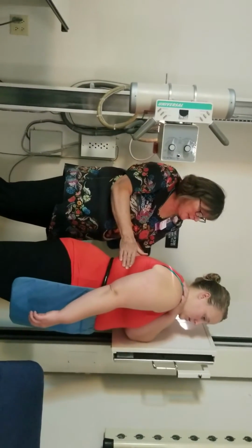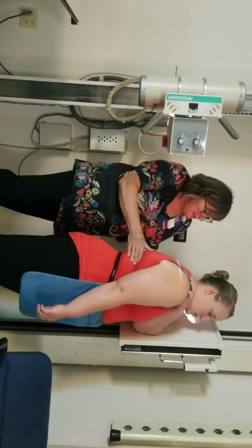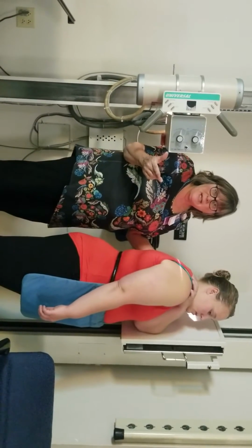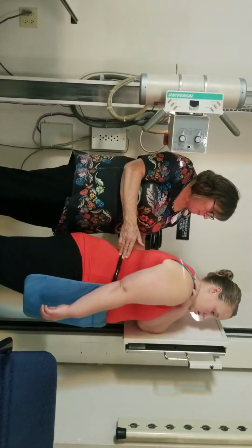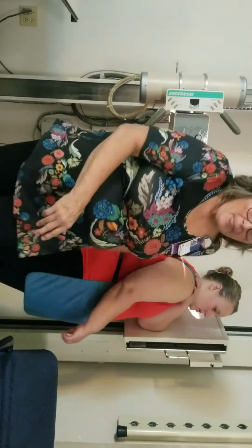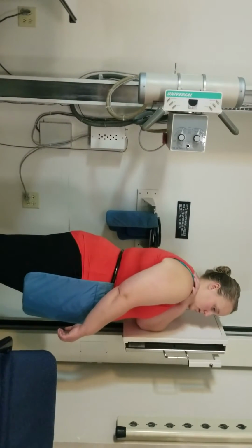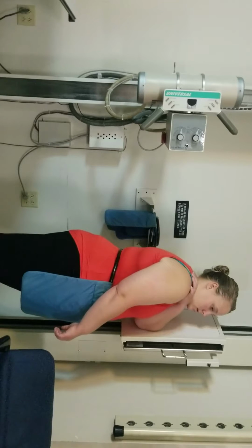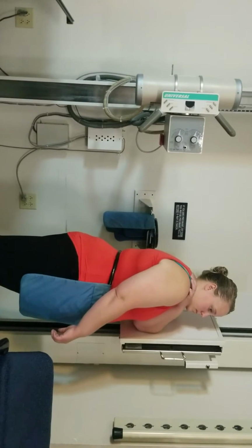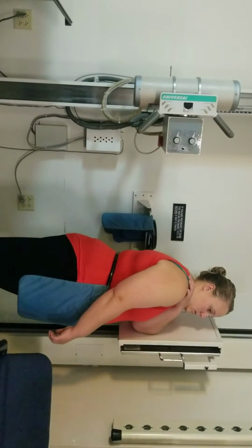So I've got her head of the humerus right on my positioning line. I'm centering just about at the same spot that I centered for my scapulae shoulder, making sure I have my inferior angle on. I'm going to up my mAs to about 20. And I'm going to have her hold her breath. Don't breathe. Good, you can breathe. You can relax.